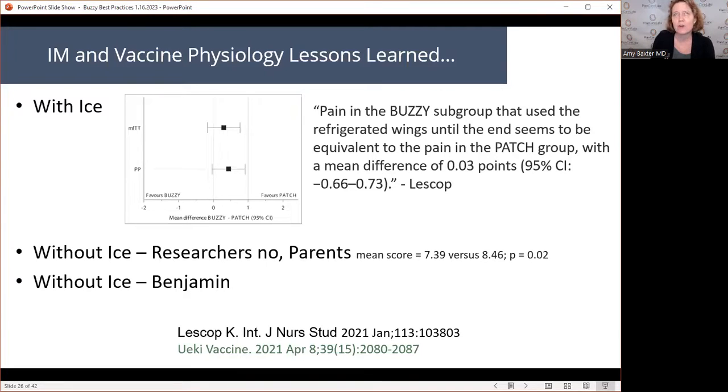And so I think that when you're introducing Buzzy, you have to realize that sometimes nurses would prefer to have a smaller number of rotating patients so they get to know them better, or just so they have more time. So there may be some reasons why people would rather have something that's going to take an hour to work, especially when it gets hard.